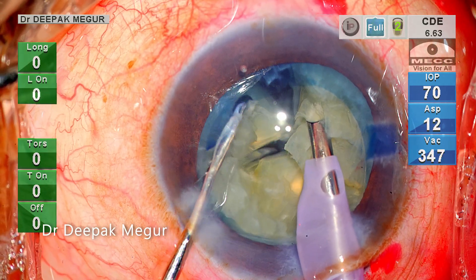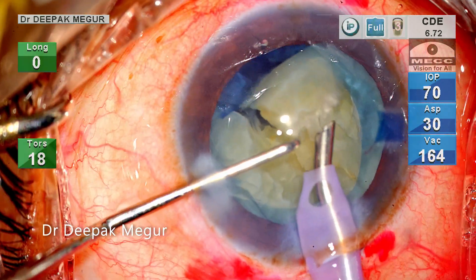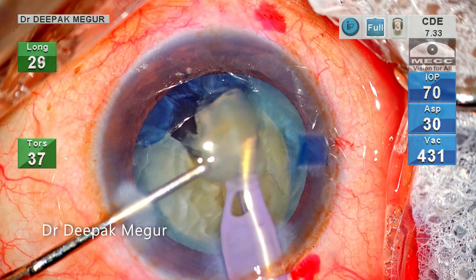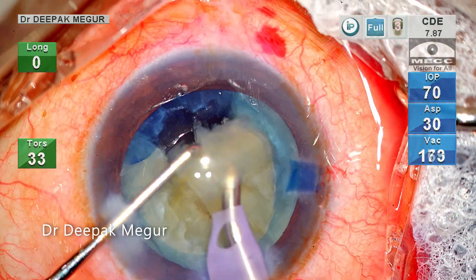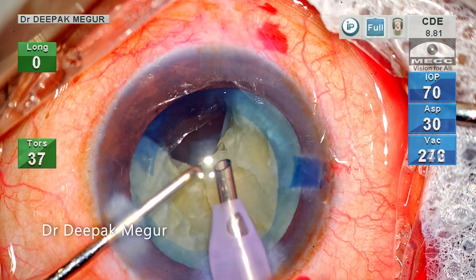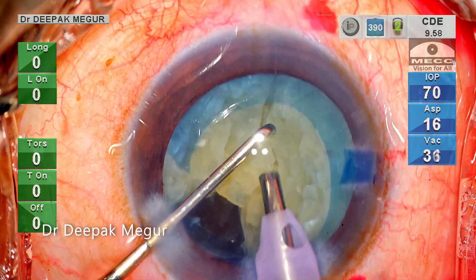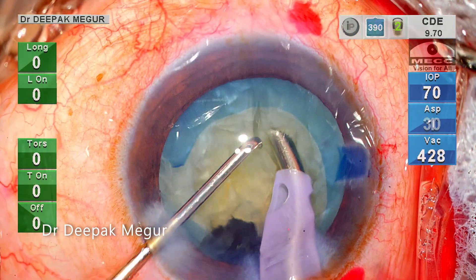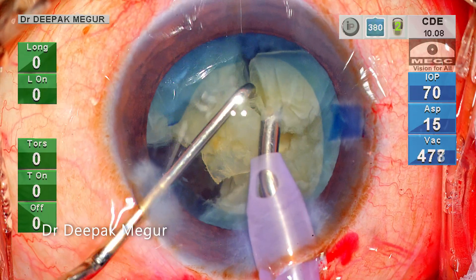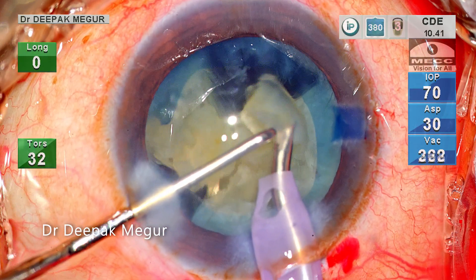The second chop is done now, and I have a free fragment which I pull out of the bag and emulsify. In a routine case I usually divide all the pieces in the bag before emulsifying them one by one. But in this case, the idea is to create more space in the bag, which is beneficial as less stress is induced on the torn edge of the anterior capsule. The emulsification of the quadrant is completed in the anterior chamber. Now the nucleus is rotated gently and subsequent vertical chops divide the hemi-nucleus into two smaller fragments.